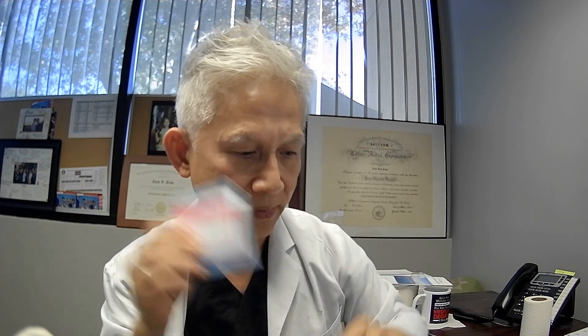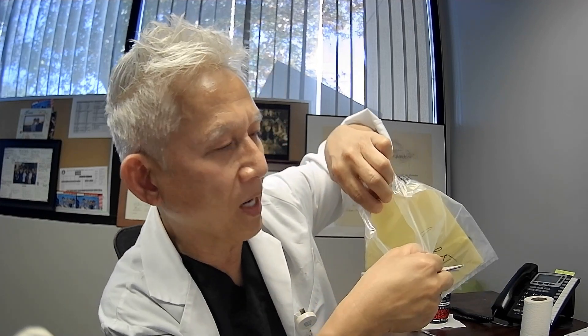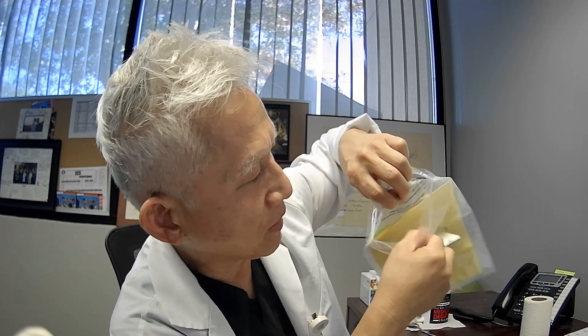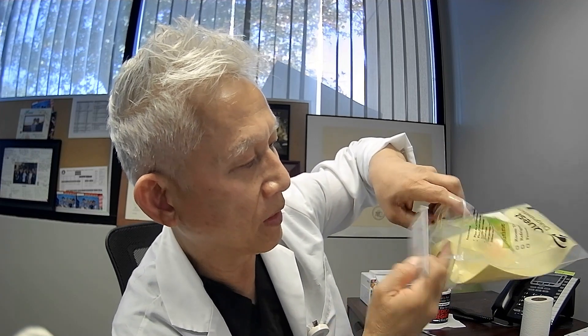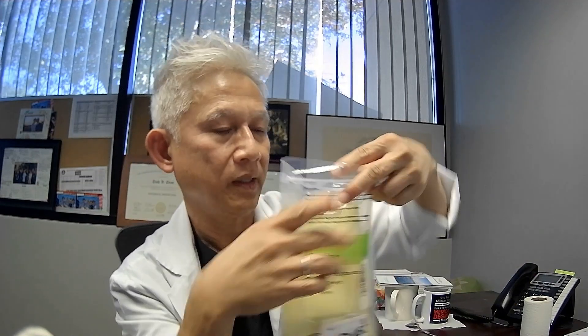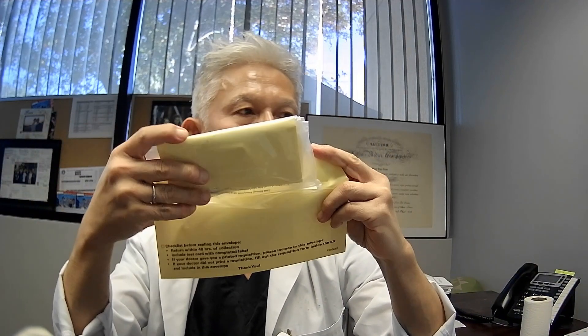Seal it over — like that. Don't remove any paper, don't remove the label here. The nurse already prepared everything for you. All you have to do is get a little bit of sample in here. Then you put it back in here. Remember, this envelope has two pockets — one has labels. So this stool sample, you put it in the other pocket here, like that. You seal it, then you roll it to make it smaller, and put it in here.